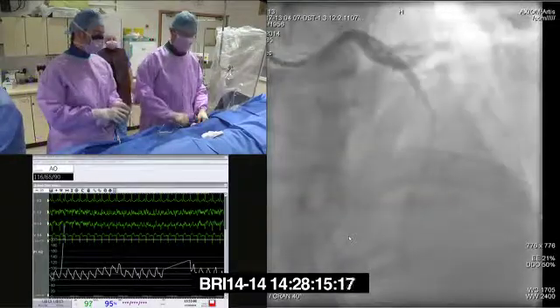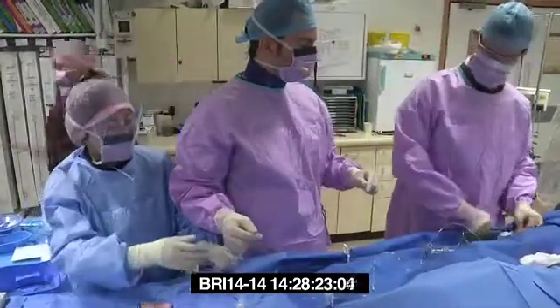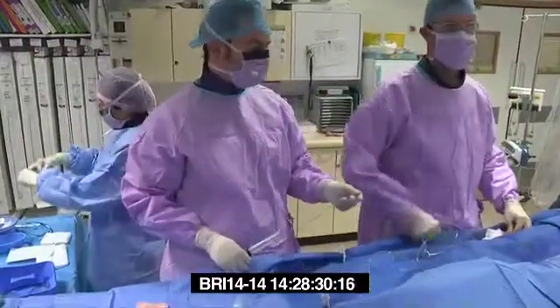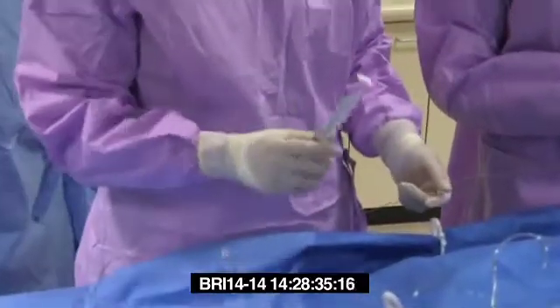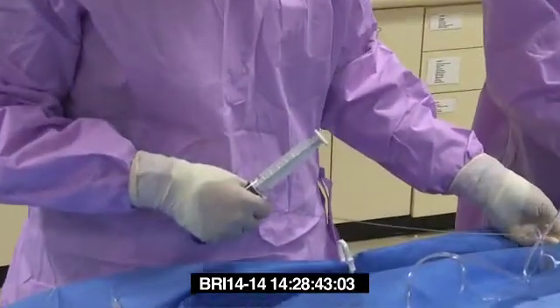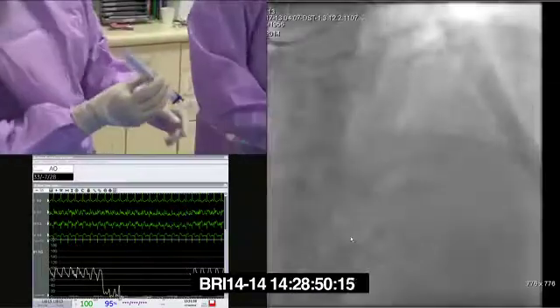Let's take the export one more time. Again, it's difficult with the current data as to whether we should export or not. It's certainly something we have done. I'm aware of the current studies, but it did certainly look a very thrombotic lesion. I think where you see excess thrombus, the registry was allowing operators to use export at their discretion. I've got the wire. So I think we've seen a heavy amount of thrombus here, and I think it's quite reasonable to do.